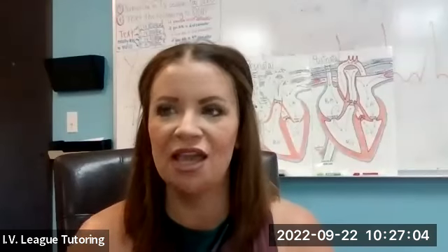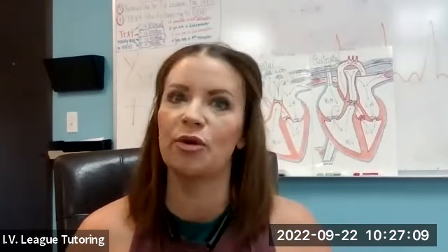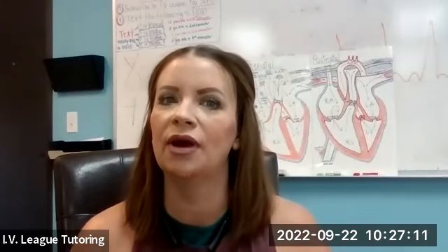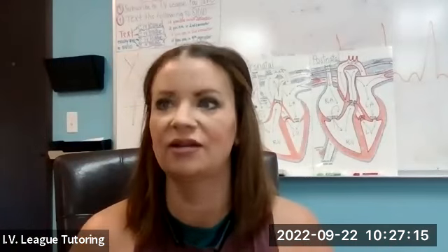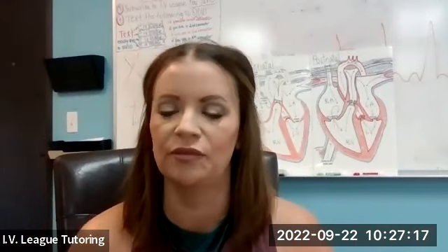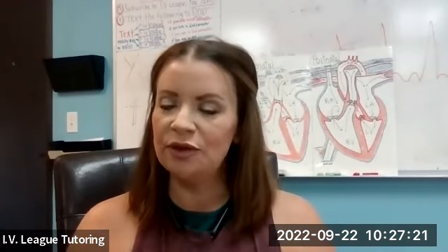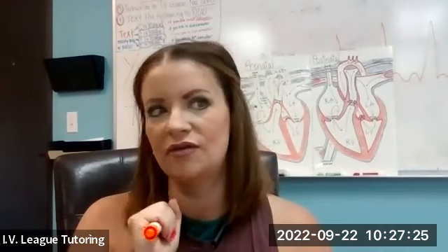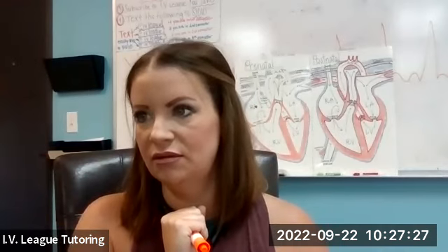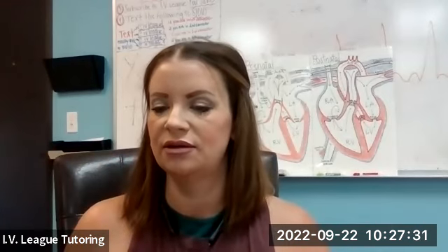Okay. Let me just make sure. If all you see are QRS complexes, what's the problem? If all you see are just QRS, that's VTAC. Does that make sense? Yes. Okay, cool. Are the P waves normal, which means they have to be smooth, round, and upright? Sometimes you'll just see a tiny blip, and that means there's something obviously going wrong in the atria. Okay. You understand your checklist. You're going to do that for every EKG.